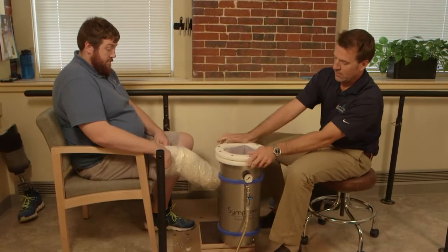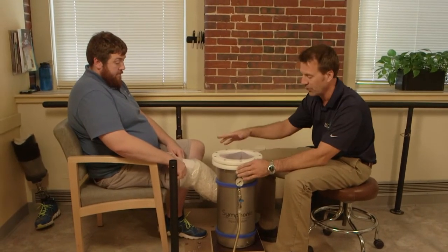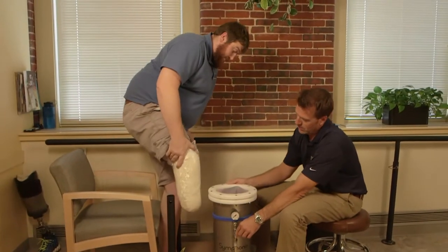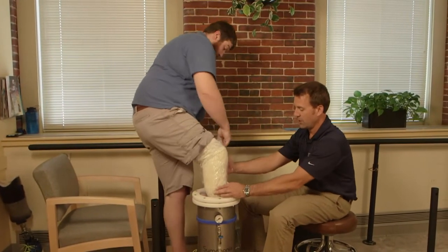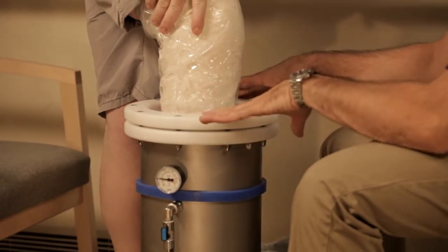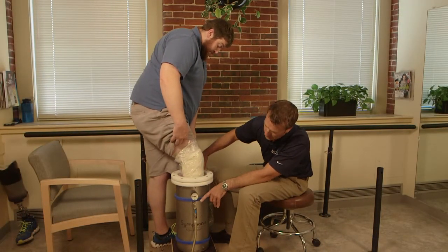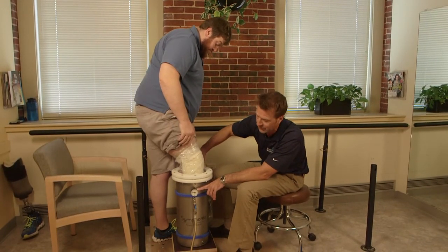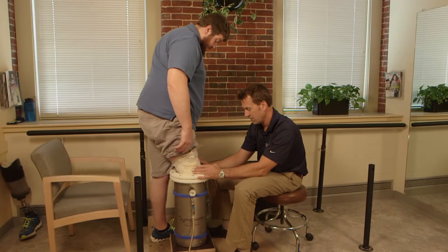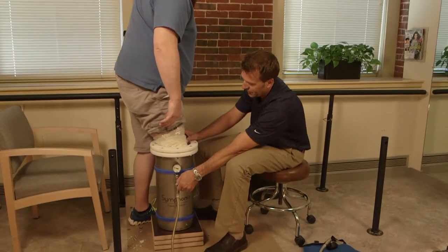The reason for that is that his limb needs to slide down into the inner bladder. We've used a water-based Vaseline-type product which will help lubricate that surface so he can actually slide in. James, I'm going to have you stand up and slowly bring your leg — the other leg forward — and start putting pressure down on here. As he's applying pressure, I'm going to release this valve, which now is allowing water to transfer from the inner bladder into the reservoir bag. I monitor the amount of water that flows out of this system, and I can also monitor the amount of pressure he is placing on his limb by this gauge on the side. I'm going to continue to watch how his leg presents inside of the casting vessel, and once I get him down just above the top of his knee, I'm going to start closing this off.